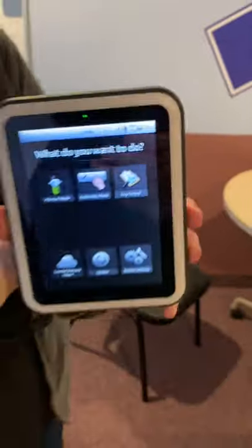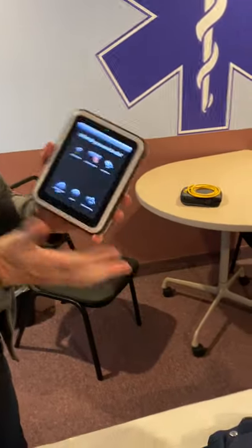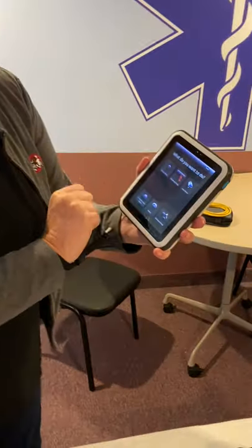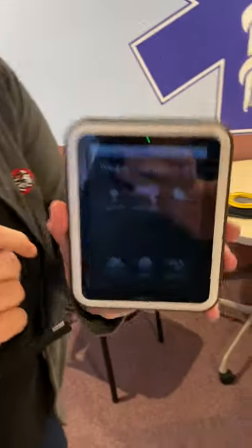That's where you really want to be aware of that 30% mark — if you see it below 30, I recommend plugging it in. These tiles are how you walk through the SimPad, but for how you're going to be running it, the tile we're going to focus on is called Manual Mode. That's how you're going to engage with the mannequin and be able to run a session with your learners.